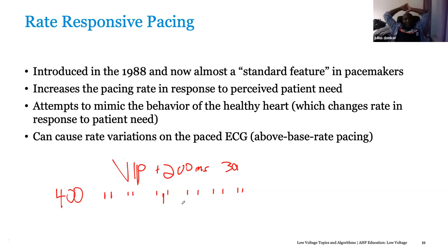Yeah, MVP, managed ventricular pacing, which is an AV node algorithm, is on Azure. It's also on Sphera, actually. It's quite common on Medtronic. Basically, all it is, is AAI to DDD. It paces the atrium if they are chronotropically incompetent, and just like AJ was saying, it will sense the AV node, just like VIP. Within a few cycles, it will check for intrinsic conduction, and if it finds any, then it'll just leave it alone and continue to support the atrium. If the patient goes into complete heart block, it will just go into DDD mode, like AJ was saying.